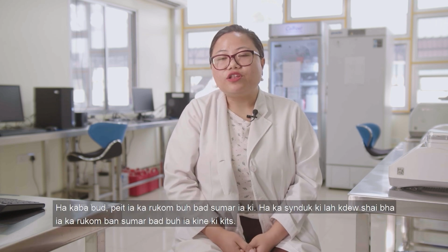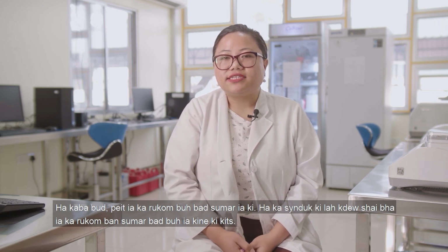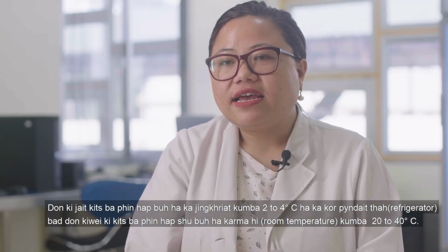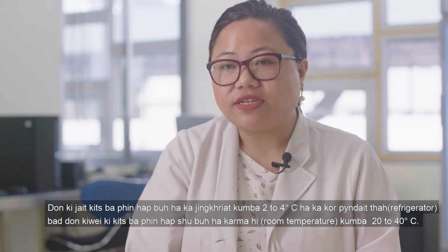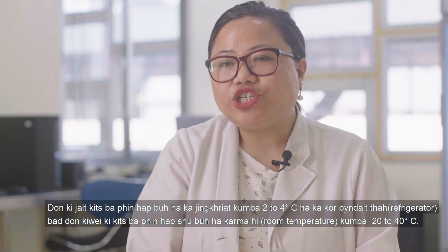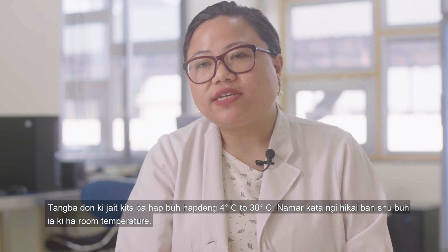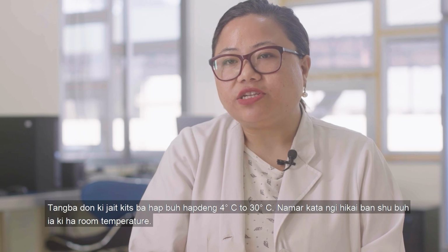The next step, you look at the storage conditions of your test kit. On the box itself, the storage condition for particular kits will be mentioned. There are certain kits that you can keep at 2 to 4 degrees Celsius, that is in the refrigerator, and there are other kits that you can keep at room temperature, that is 20 to 40 degrees Celsius. But there are certain kits wherein the temperature lies between 4 degrees Celsius to 30 degrees Celsius. So we advise that you keep it at room temperature.